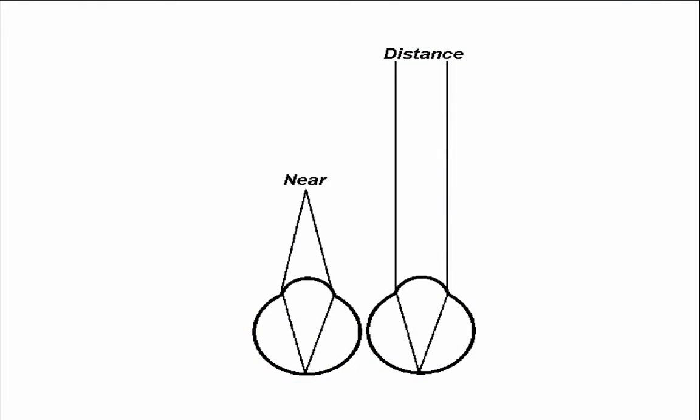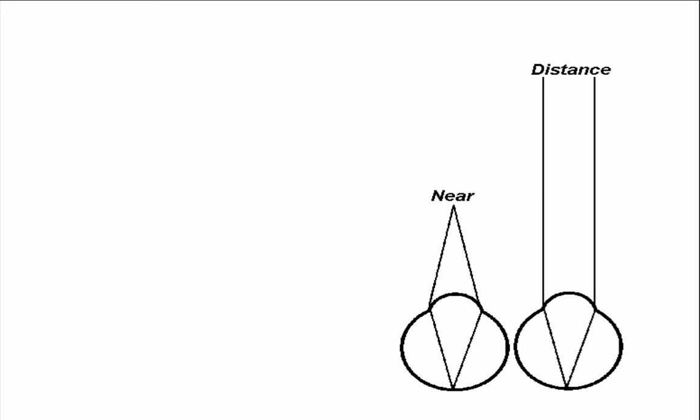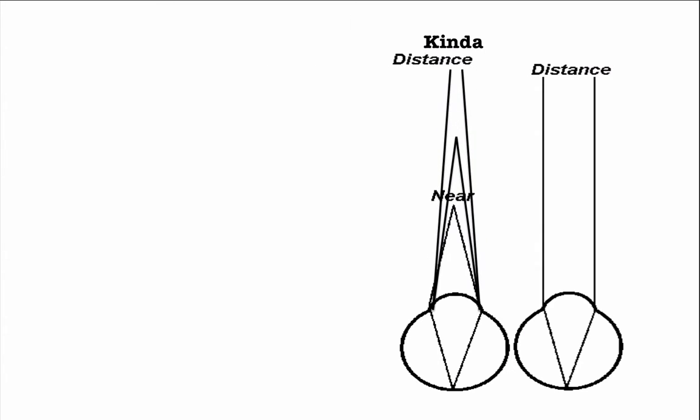We tend to avoid straight monovision for our patients unless the patient has previous experience in it because of the limitations that it gives at some or many distances. We may start an emmetrope off in a modified multifocal vision using a multifocal lens in the non-dominant eye or least dominant eye. Our goal is to have them experience some level of improved near vision.